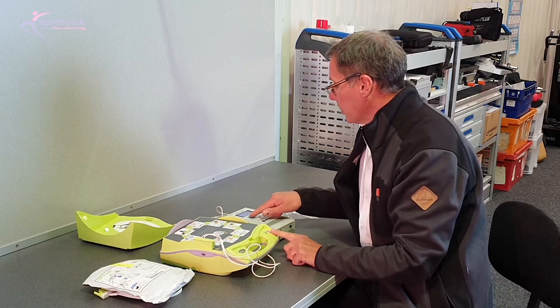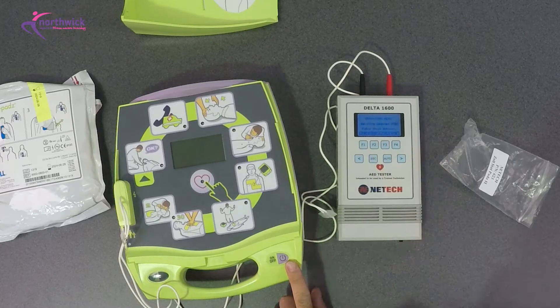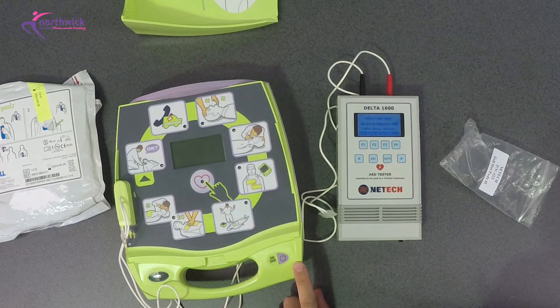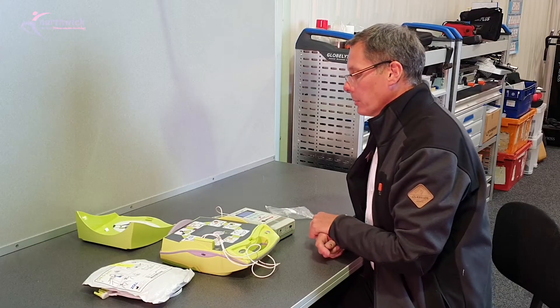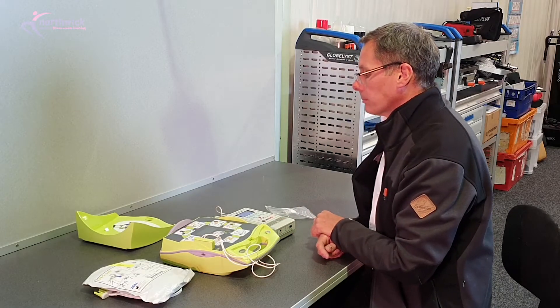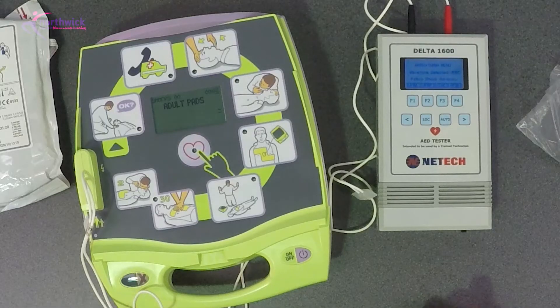So I'm going to put the test equipment onto the arrhythmia pattern that would require a shock, and we'll turn the device on and we'll let it go through its sequence. Adult pads unit, okay.